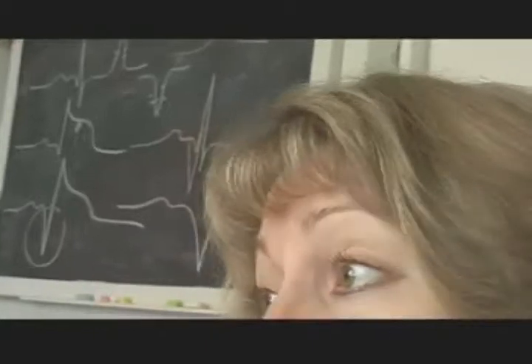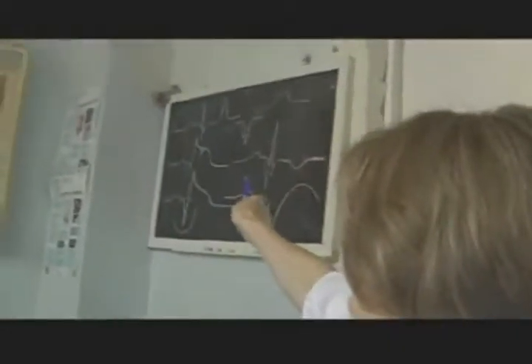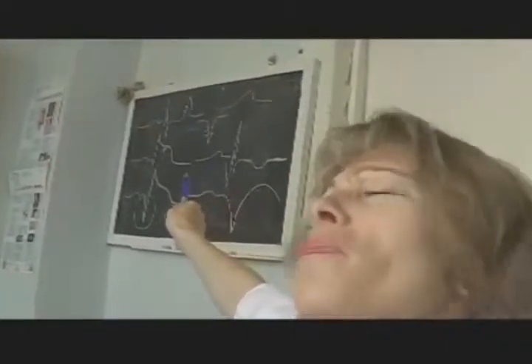And when you answer these questions, you gradually must examine, firstly, what wave? Firstly, the T wave. Firstly, we'll exclude ischemia. Then we'll pay attention to the complex. ST segment. We must compare it with the isoelectric line.